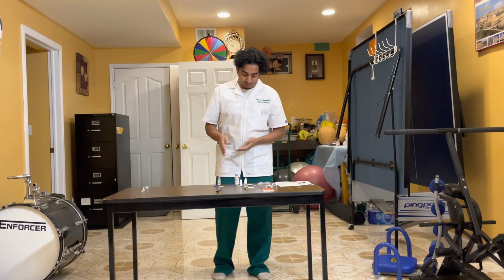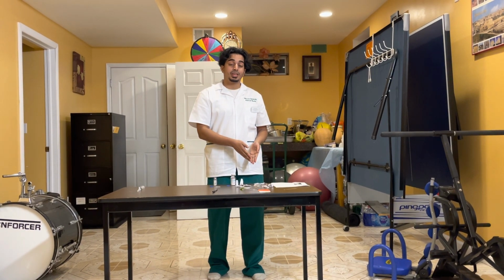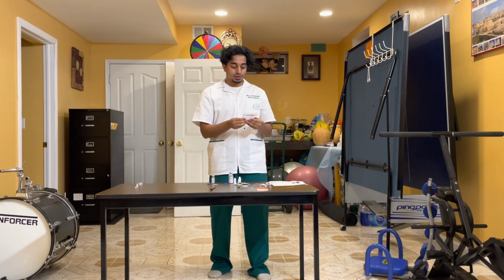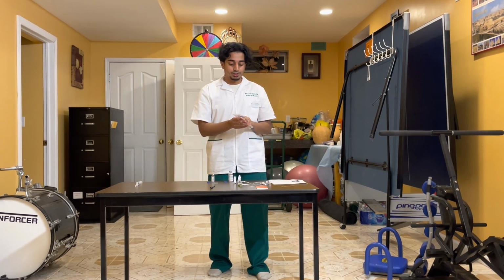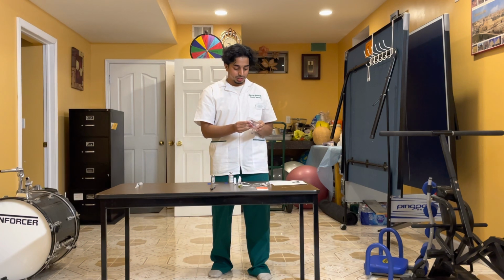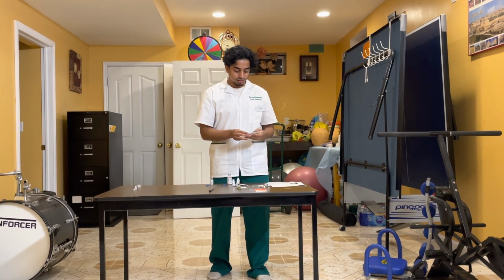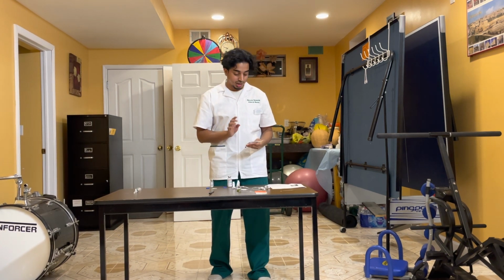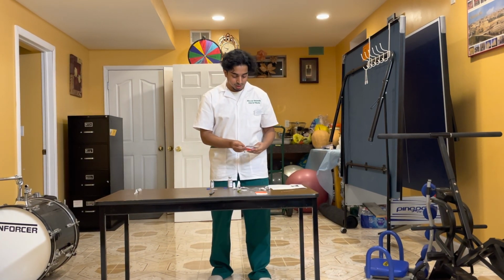Now once I do that, I have my IV piggyback bag. I take it out. I make sure it is right, the normal saline. I make sure there's no issues with the bag. Okay. Now I see that there's no issues with the bag. I'm going to check the expiration date. Expiration date is perfectly fine, no issues. Perfect.